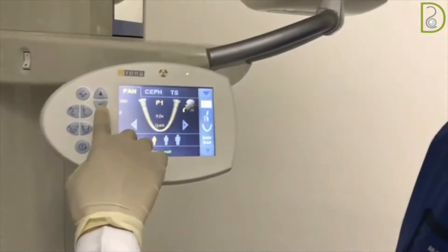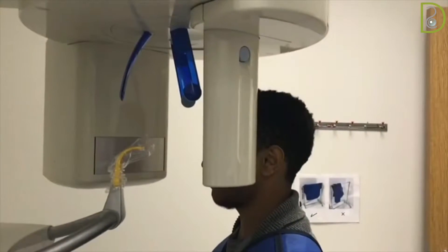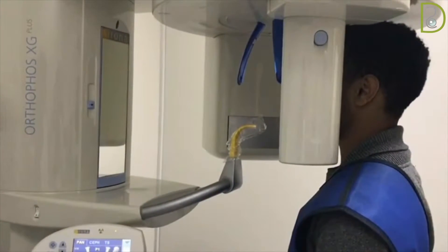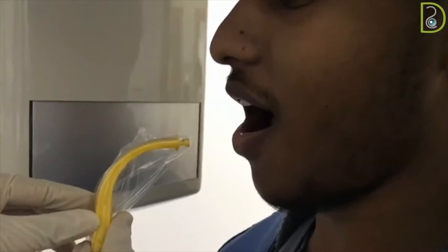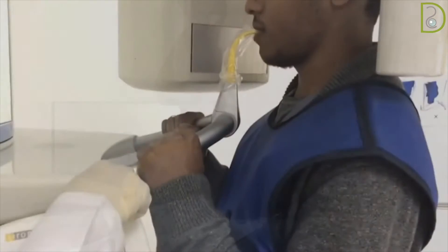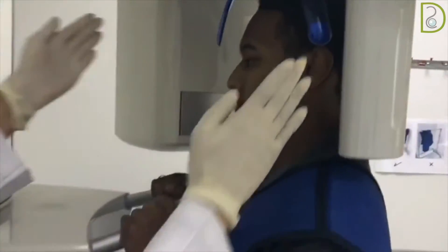Adjust the unit using the control panel, as the temple support should be in contact with the patient's head. The patient is instructed to bite edge to edge on the bite guide. Ask the patient to hold the handle and stand straight. On the control panel, adjust the temple support to immobilize the head.